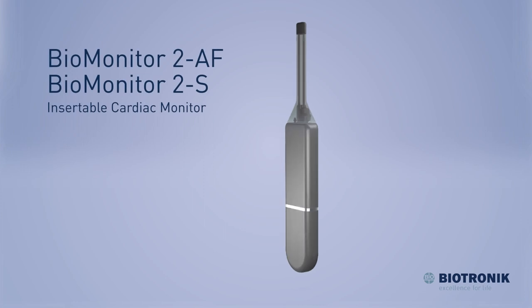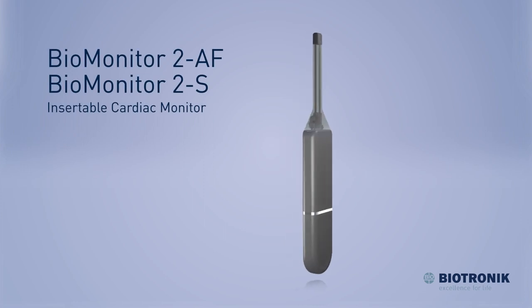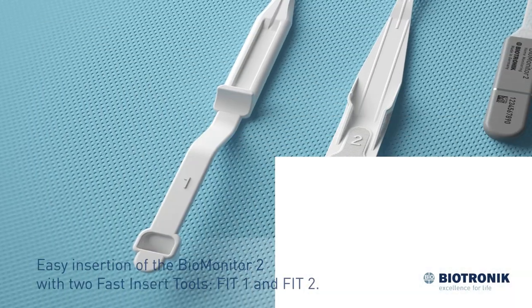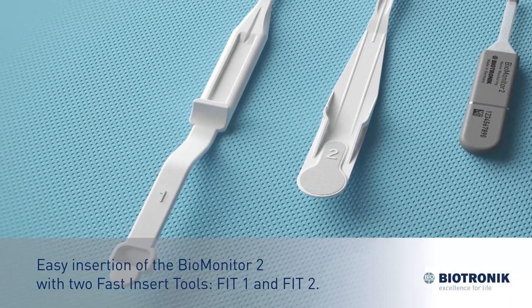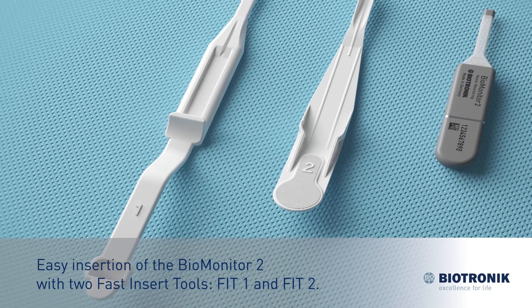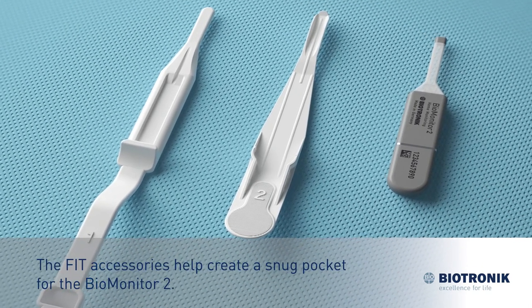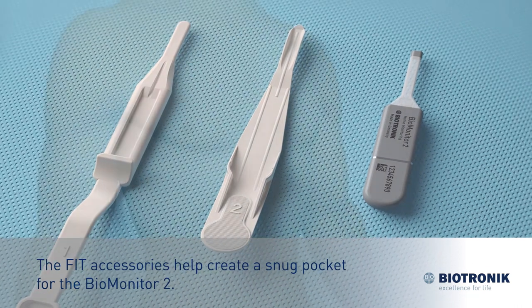Biomonitor 2AF, Biomonitor 2S, Insertable Cardiac Monitor. Easy insertion of the Biomonitor 2 with two fast insert tools, FIT1 and FIT2. The FIT accessories help create a snug pocket for the Biomonitor 2.